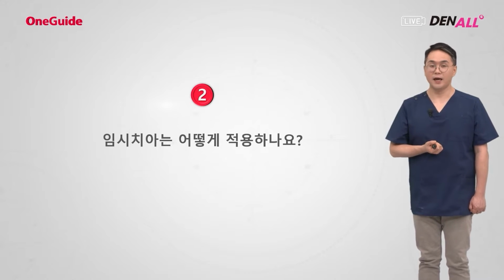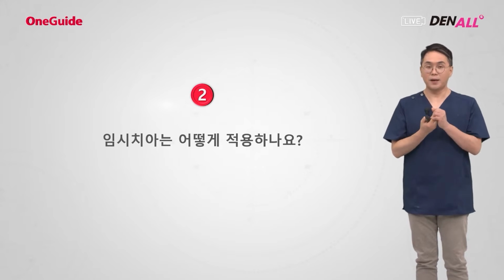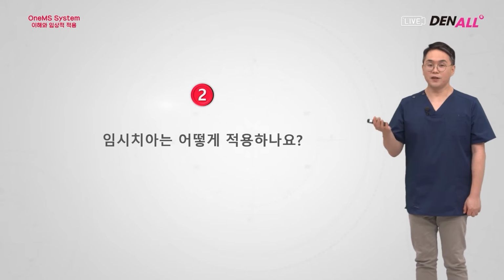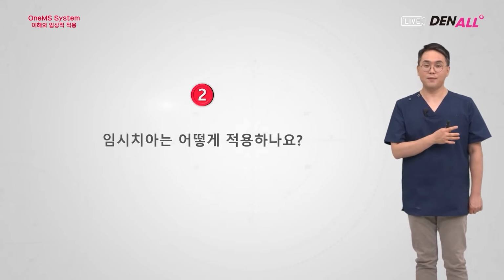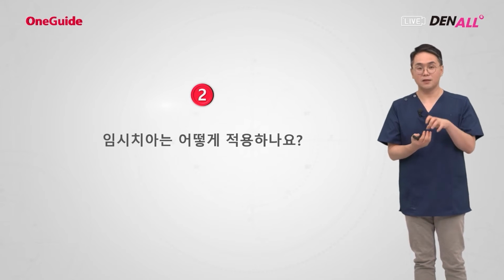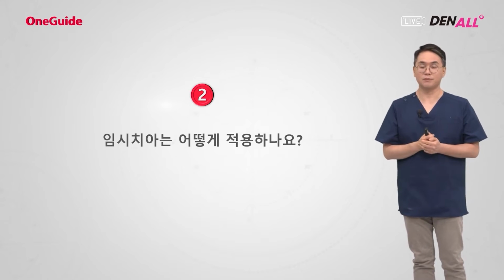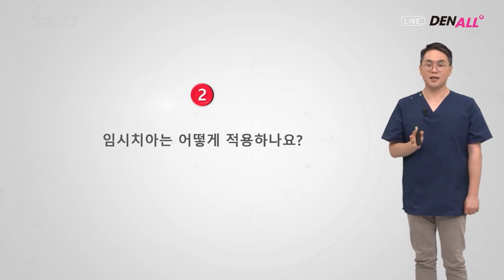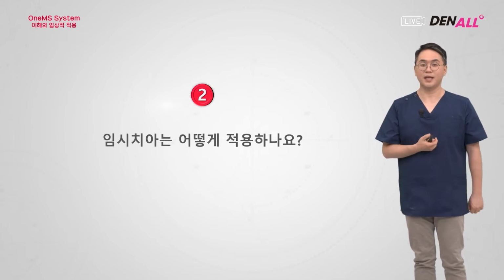Next, how do you deliver temporaries or provisionals? In the first case of the MS implant, a provisional cap was placed on the abutment, and on top of this, there was cementation. But at the Austin Digital Center, if you tell them to use the OneMS system, a temporary that fits your abutment will come. It might be a new step, because after placement, if you want to put a provisional on top of a prefabricated temporary cap, it doesn't fit, because there is no temporary cap library, only a library for the abutment. So using the OneMS system and placing the OneMS implant, the temporary plastic cap will not have to be used. You can just cement to the abutment. That is the difference, so I hope you will not get confused about this.